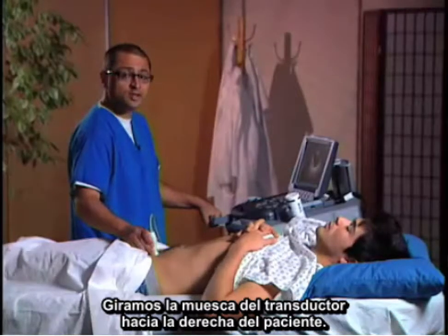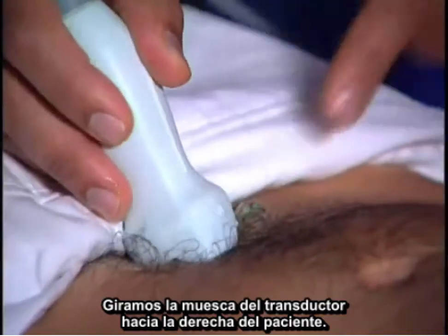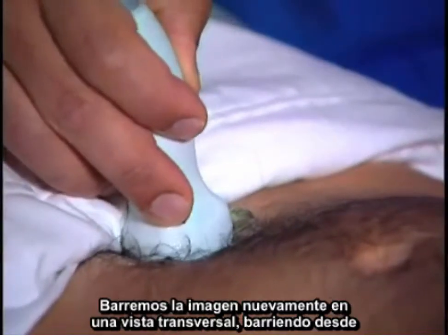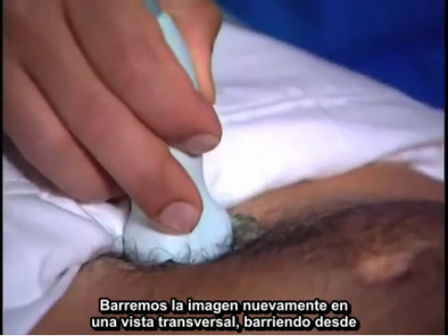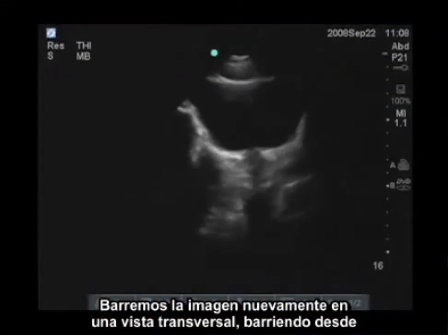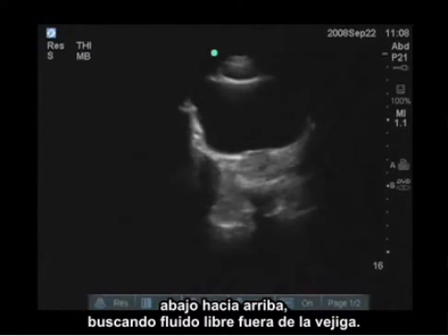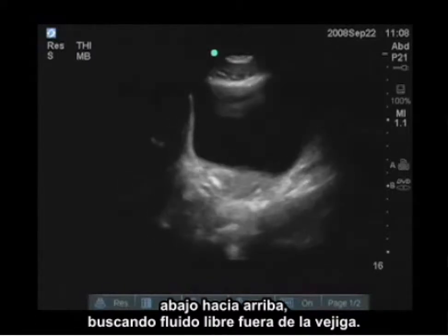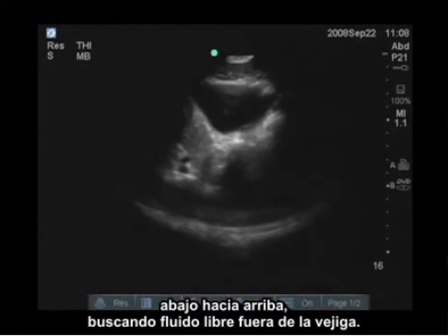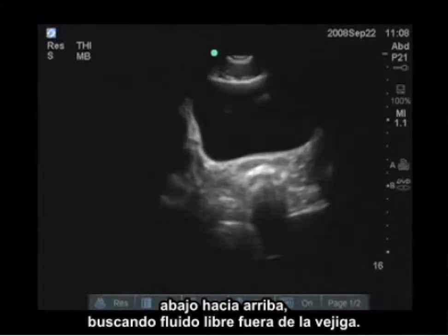Once we're satisfied that we can see the full bladder in a sagittal fashion, we're then going to turn the transducer marker toward the patient's right, and we're going to scan again. Now we're in a transverse view, and we're scanning from very inferiorly to superiorly, looking for free fluid outside of the bladder.